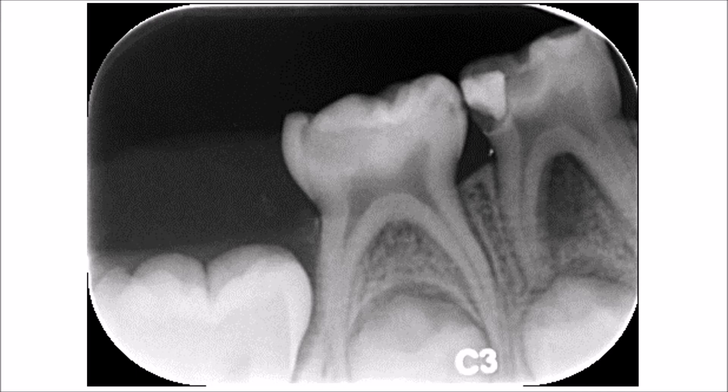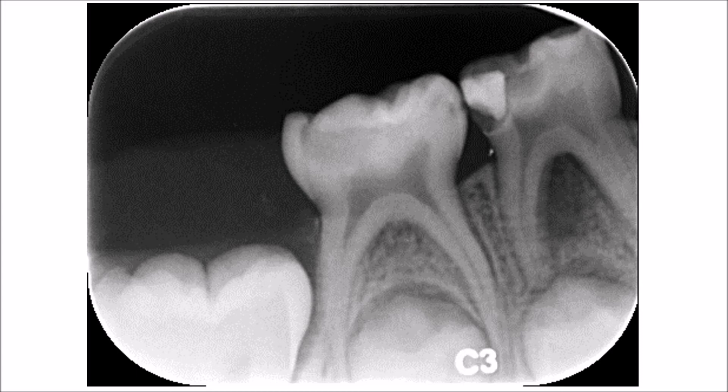The distal side of the same tooth — that is the second deciduous molar — you will see a large radiolucency in this area, which assumes exactly the typical appearance of dentine caries.